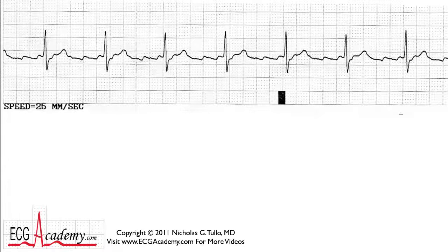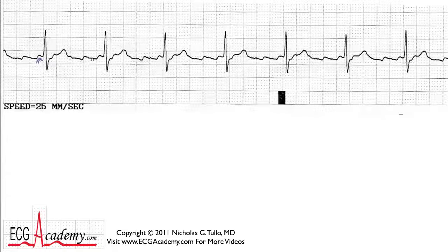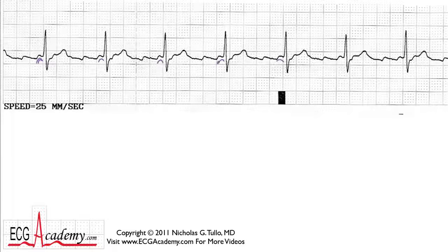What should we do now is look for atrial activity — what's the atrium doing? The best place to look for P waves is in front of the QRS complex. If you look in front of this QRS, there's a bump right here that kind of looks a little like a P wave. Looking at the next QRS complex, there's the same signal. There's a bump in front of every QRS complex. But if this were a P wave and you measured the PR interval, it would seem to be somewhat short — perhaps 120 milliseconds or so.